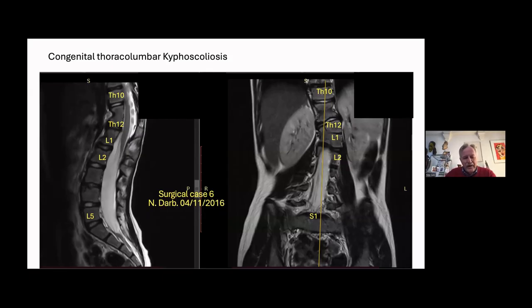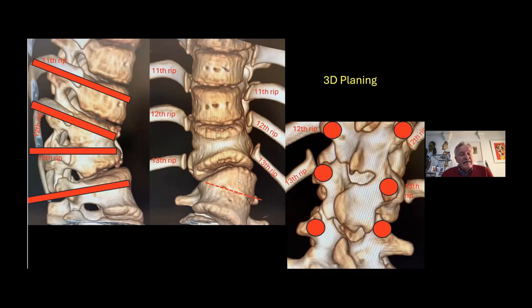So we have to figure out which one of these vertebrae is responsible for the deformity. So this is the CT reconstruction, where we try to identify the possible insertion points for the pedicle screws when we want to keep the whole surgery limited to this localized problem. And you can see here the deformity with the kyphosis of this vertebra, which is also malformed. And here you see an unsegmented hemivertebra. And so this is a combination between these two things.